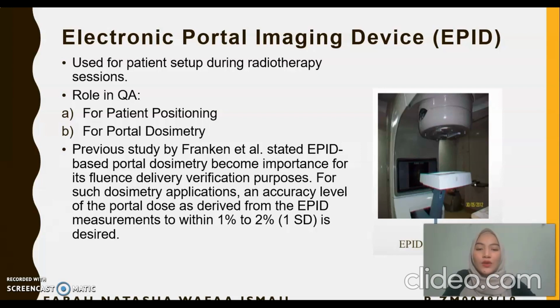Therefore, quality control in radiotherapy is needed before and during treatment so that we can ensure a high level of accuracy which is necessary for treatment design. The purpose of conducting quality control is to achieve adequate tumor control and reduce normal tissue complications.